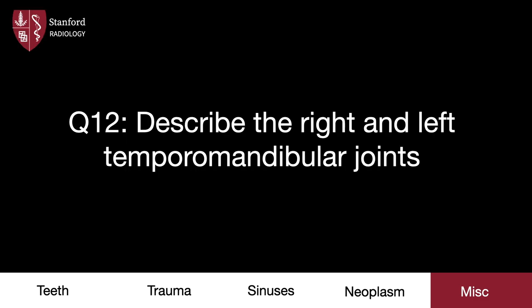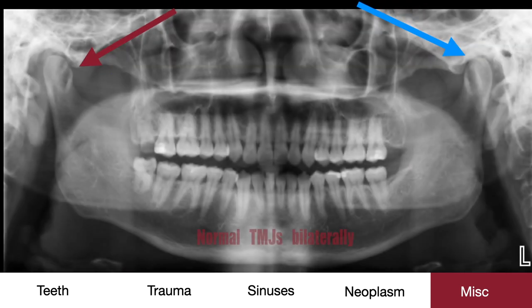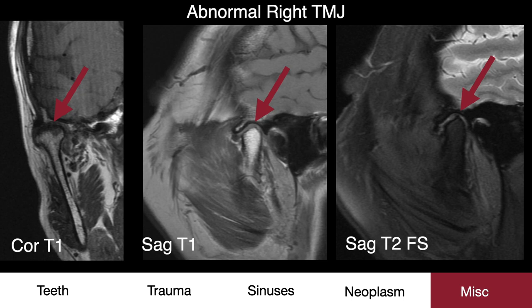Here's a final case — describe the right and left temporomandibular joints. The TMJ consists of the mandibular condyle with the glenoid fossa of the temporal bone. Note that on the right, the joint space is narrowed relative to the left. As a refresher, a normal TMJ should show joint spaces that are not narrowed on both sides, with no abnormal sclerosis of the mandibular condyles or glenoid fossa. Going back to the original case, here is the follow-up TMJ MR. Note how the morphology of the condyle is diamond-shaped, suggesting osteophytic degenerative changes.